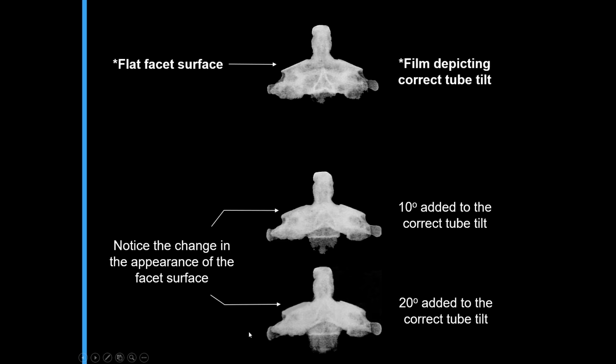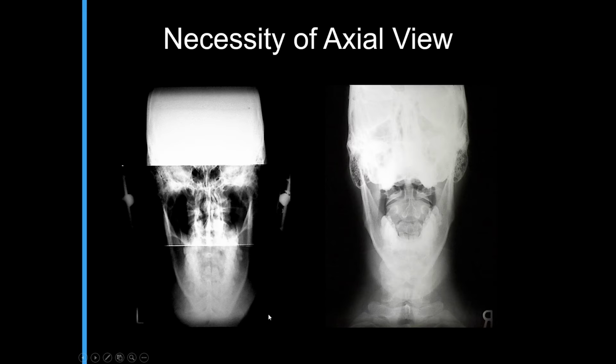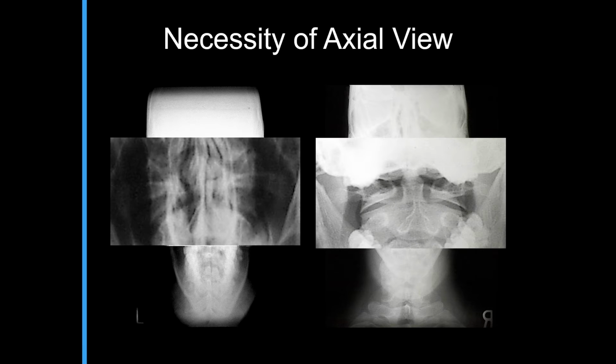So we're just showing you here how flat they are in comparison to getting rounded and more rounded. It's crucial that when we're analyzing this x-ray, we want to be straight across this way, or else it would change our z vector. Again, this shows the necessity of this, how clear it can be. With CBCT, not really an issue.